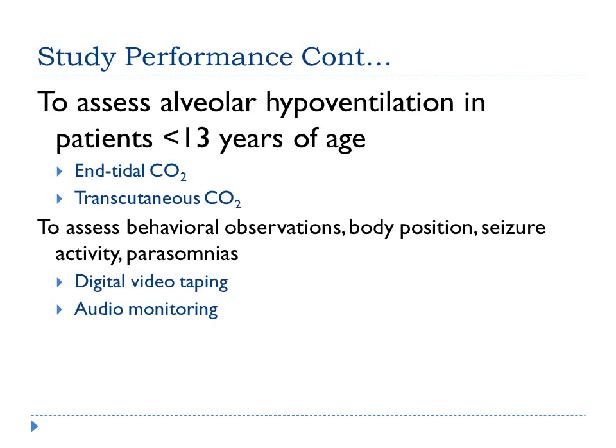With our sleep disordered breathing, to assess alveolar hypoventilation in patients less than 13 years of age, we do use end-tidal CO2 monitoring or transcutaneous CO2. This is a requirement by the AASM, or a recommendation by the AASM. To assess behavioral observations, body positions, seizure activity, and parasomnias, we need to include digital video recording and audio monitoring. However, above all, one of the most important aspects of pediatric polysomnograms is the technologist documentation. Anything you see, even though it is being videotaped, you want to be able to document to keep a record. Let's go on to our next slide.